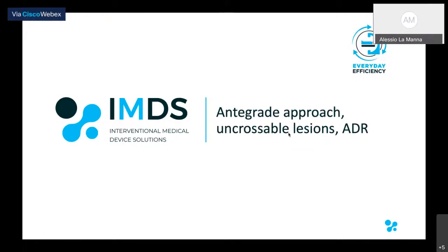So the first step today is the Antegrade approach. In the next webinar, we will discuss the retrograde approach.